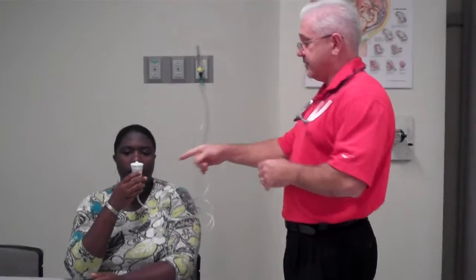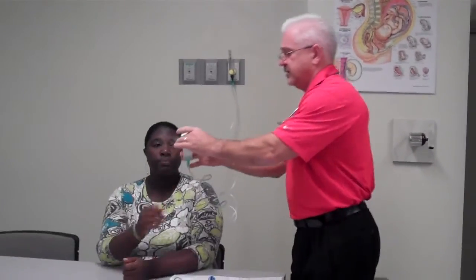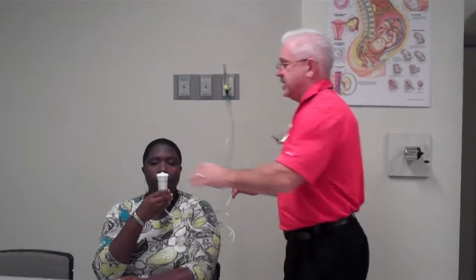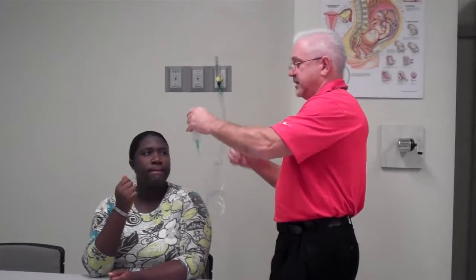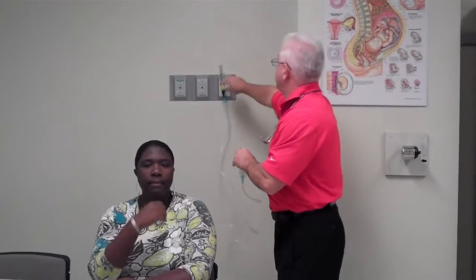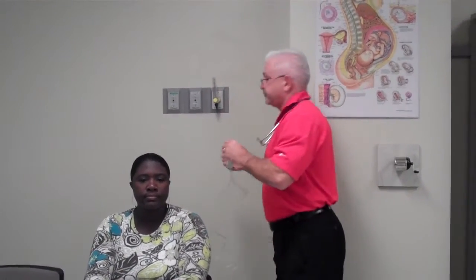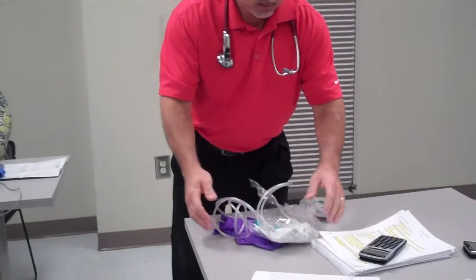This treatment will probably last about 10 minutes. After this starts to sputter the first time, I'm going to ask, can I please have that for a second? I'm going to tap it a couple of times, and I'm going to ask her to take some more. At this point, it started sputtering a second time, and there's none left on the nebulizer. At this point, I'm going to shut the nebulizer off, and I will place this, just for the time being, back into the treatment bag.